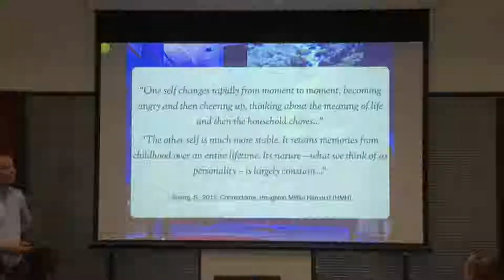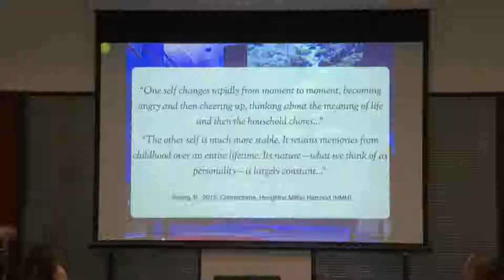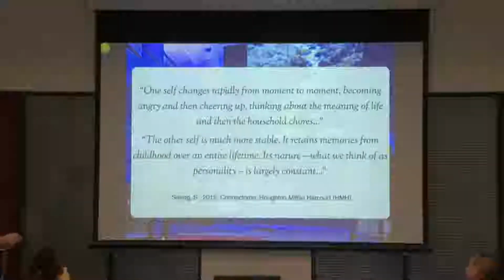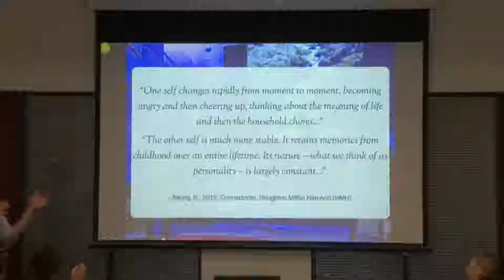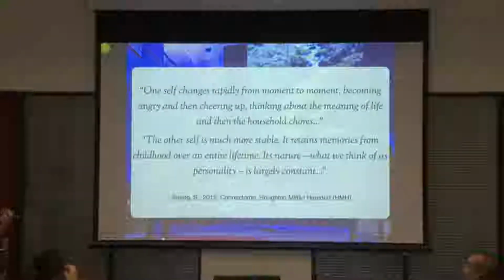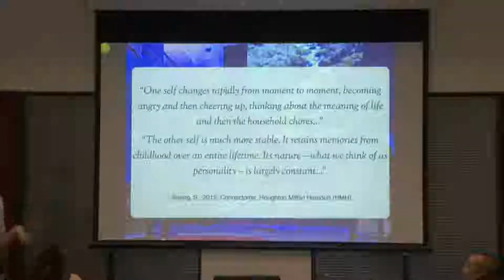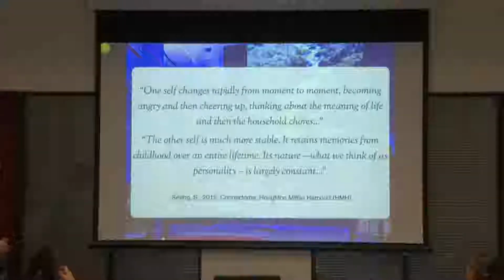And he basically claims that this part of self is the structural connectome, which only changes very slowly over time, but this one may be the functional connectome. It's what your brain is currently doing and what is happening in terms of connections. And he would say that your self is basically based on your connectome. But of course with imaging we only have a very low resolution, so we cannot really see everything.